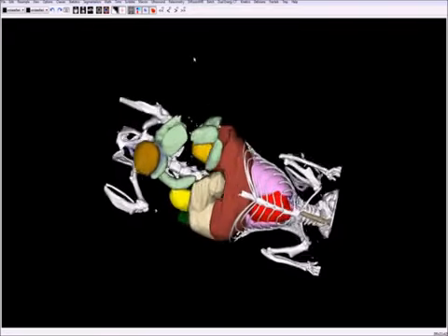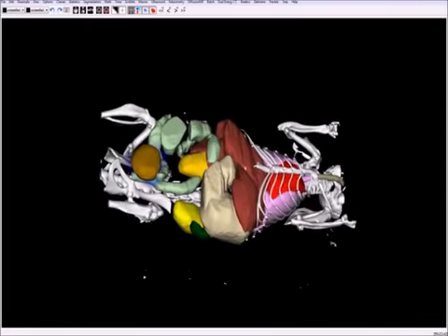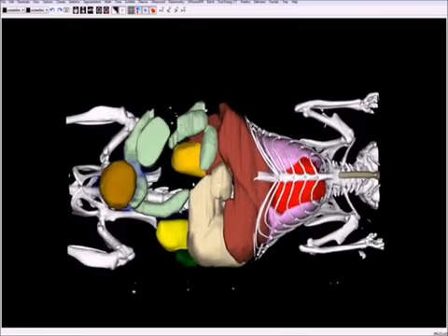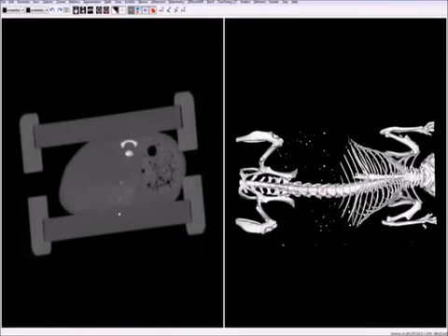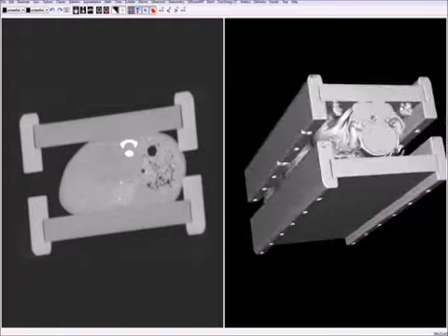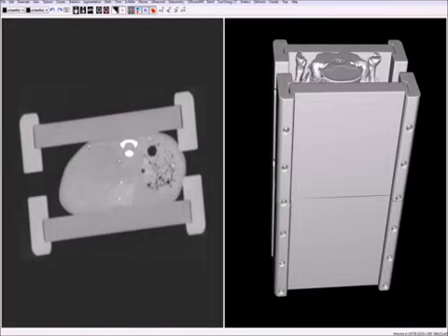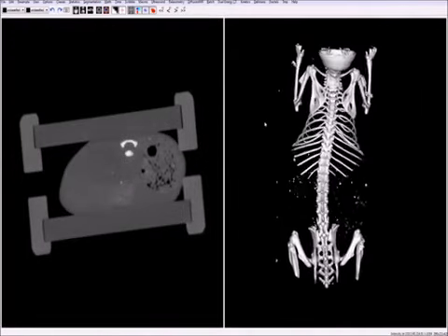In the following, such a segmentation is shown in fast forward. An experienced person can perform it in around 10 to 20 minutes. First, the CT dataset is loaded. It can be inspected in 3D using an ISO surface rendering. By changing the windowing settings, the ISO value can be changed, for example, to visualize bones or the entire mouse body with the mousebed.